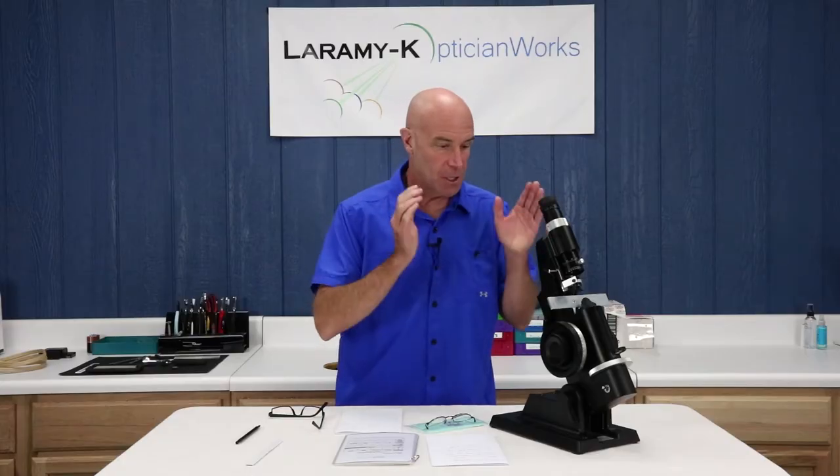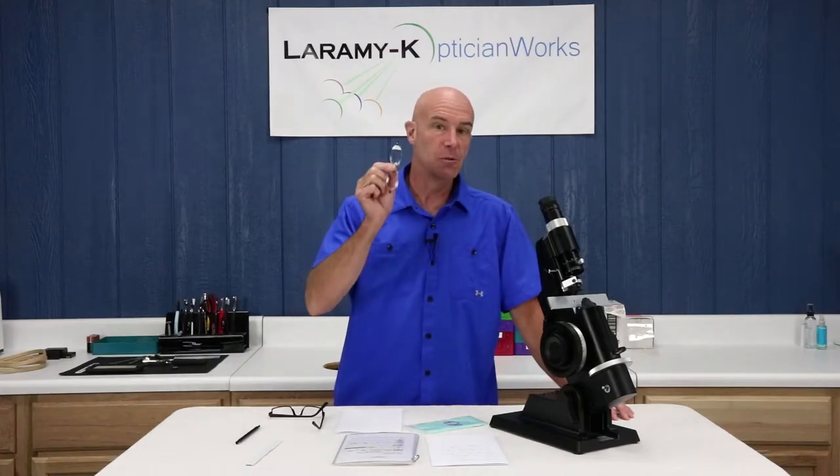Hello, and welcome to our ninth and final installment of Let's Learn How to Use the Lens Meter. Today we're going to talk about using it to neutralize a pair of glasses. What does that mean? That means when somebody hands you a pair and you have absolutely no idea what's in them.